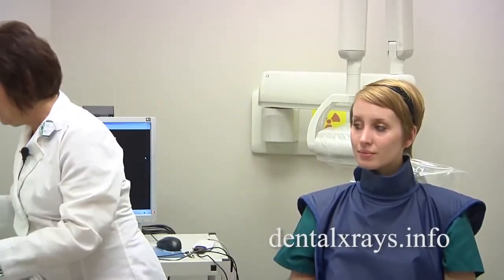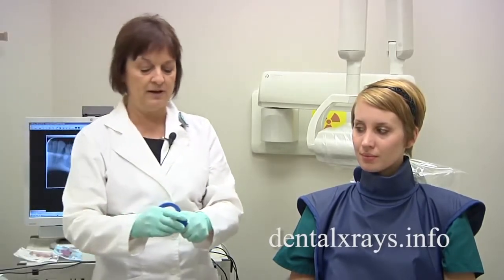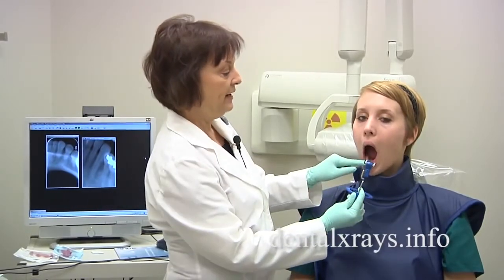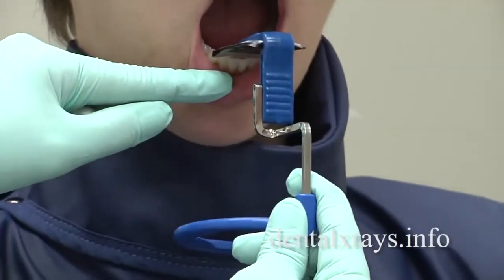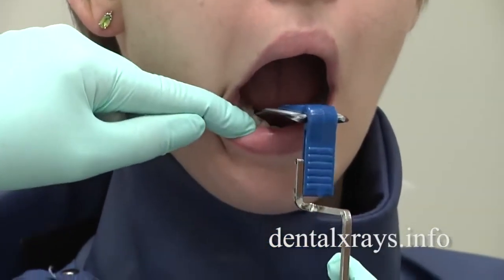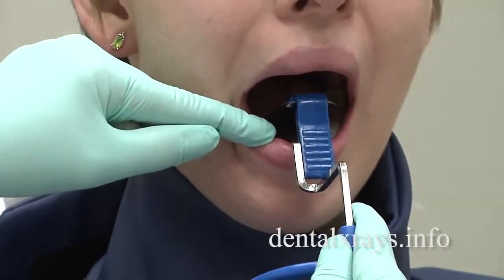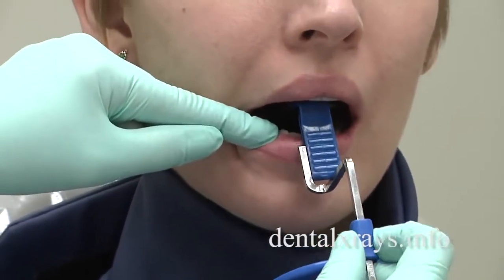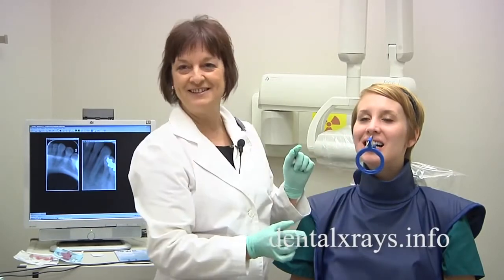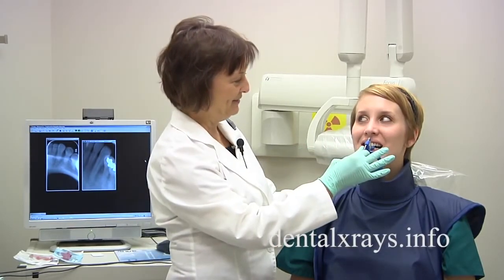Ideally on her, it would have been great to have the size 1 film, and I'm going to show you how much easier it is to place it. The bottom edge you can actually place a little bit closer to the teeth behind them. She's still so narrow, I'm still going to have to go quite a ways back. But before she bites, roll it up and then close — see how that actually works a little better than just closing down.